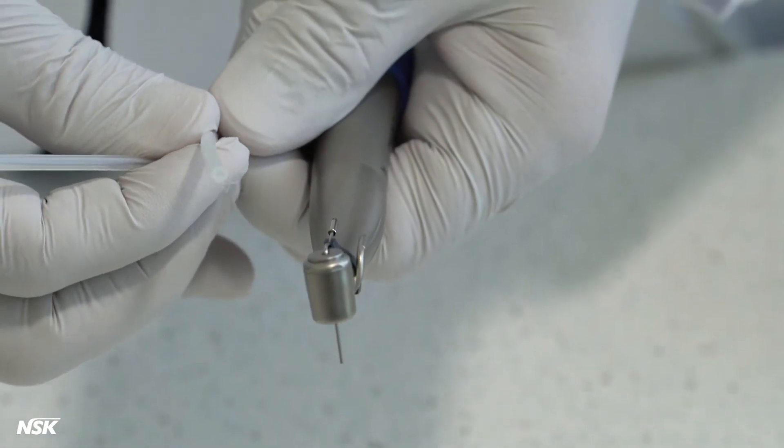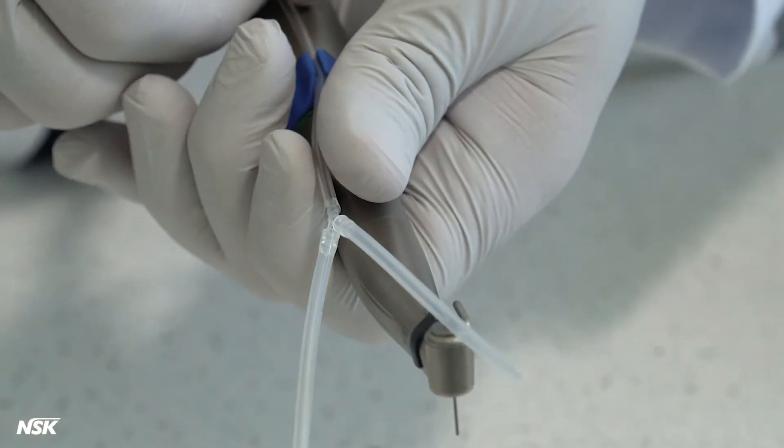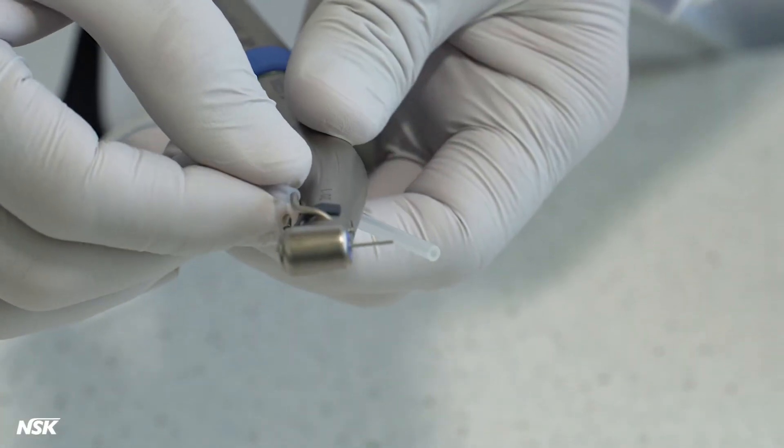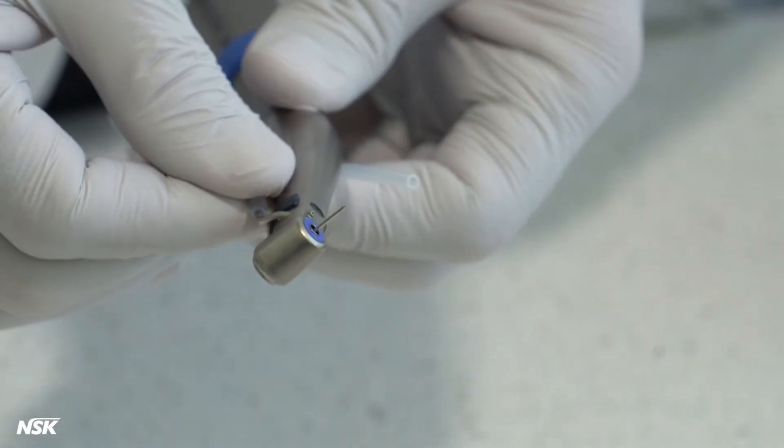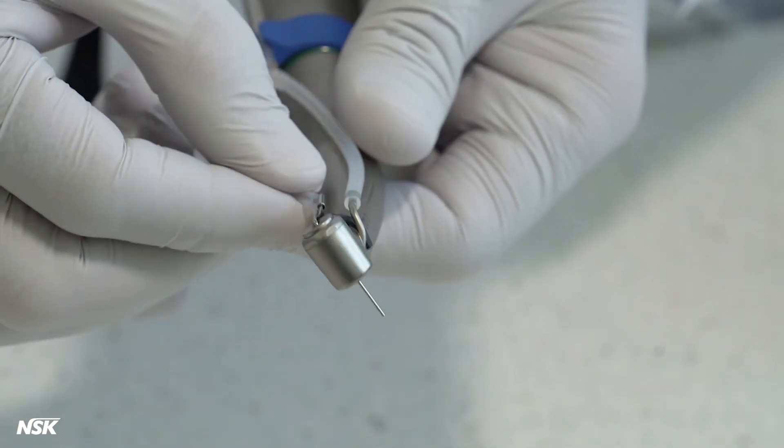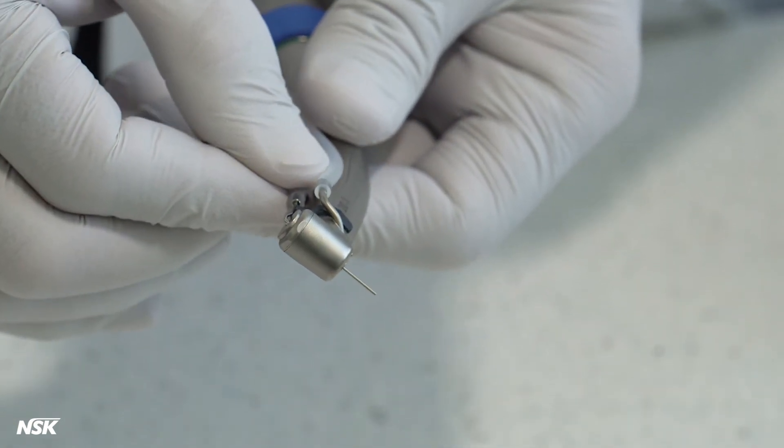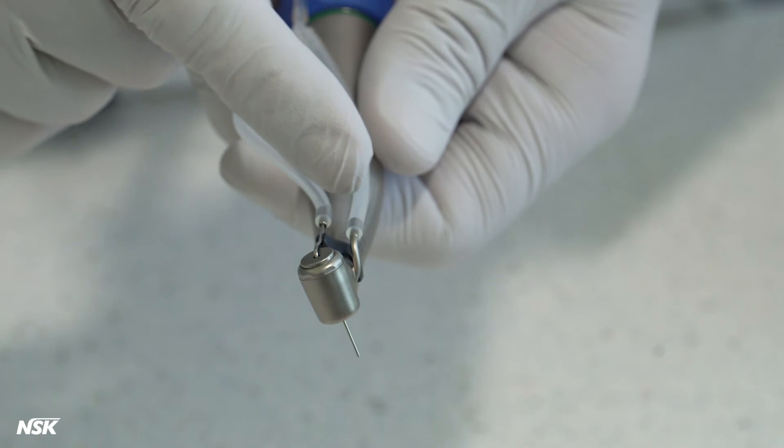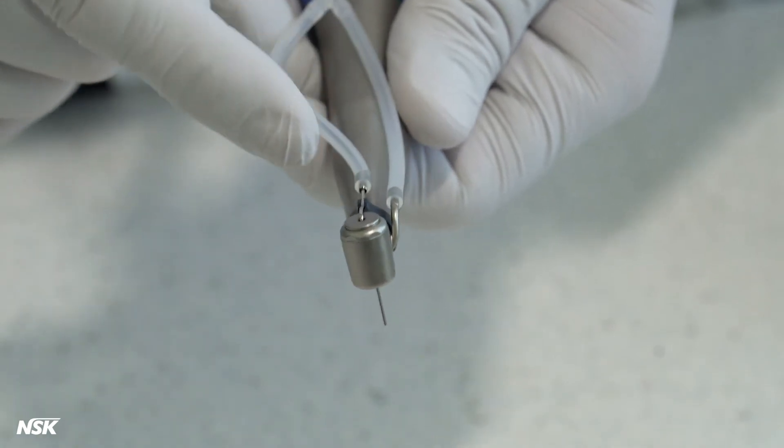Simply connect the Y connector to the end of the main irrigation tube. Then, connect one of the water supply tubes to the external spray nozzle, so the free end of the Y connector is connected to the internal spray nozzle. This dual irrigation setup is only used in unique cases with certain drills.